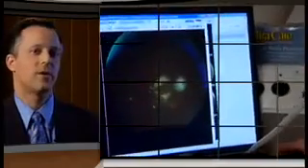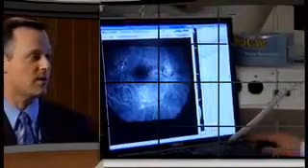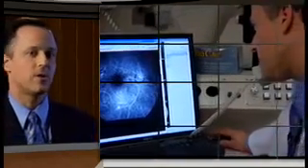So these are the benefits that you can gain from an imaging system such as ANCA, where you can coordinate all your images in one spot. For our department, I know it's been very useful. So in conclusion, I'd like to thank you for coming today, and if you have any concerns or questions about ANCA, I'd always be open to any questions and give you any suggestions that I might. Thank you.